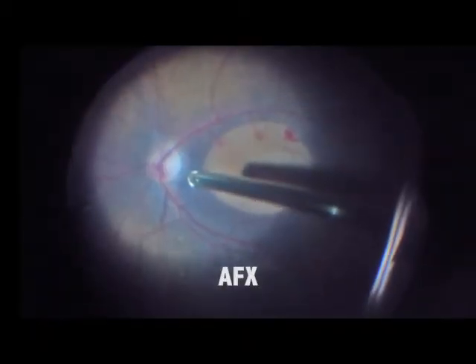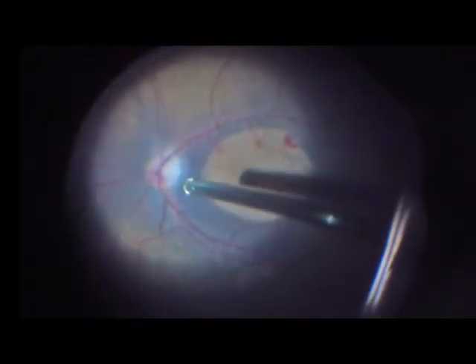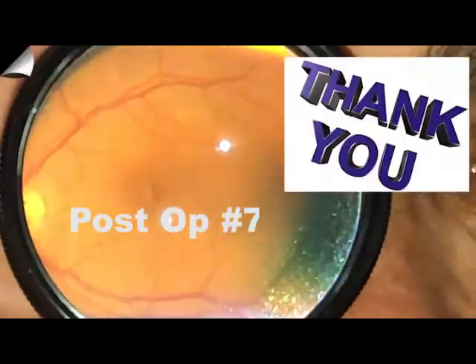We proceed now with another air-fluid exchange. Post-operative day 7 shows very clear media, a clear lens, and a closing hole with the edges approaching.